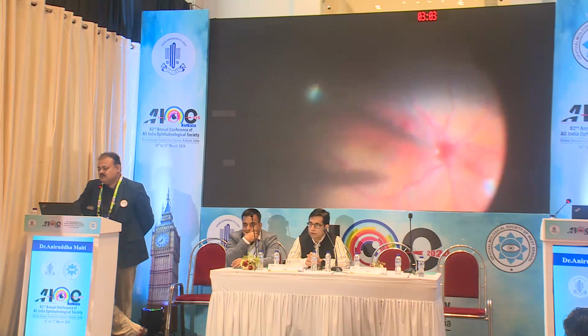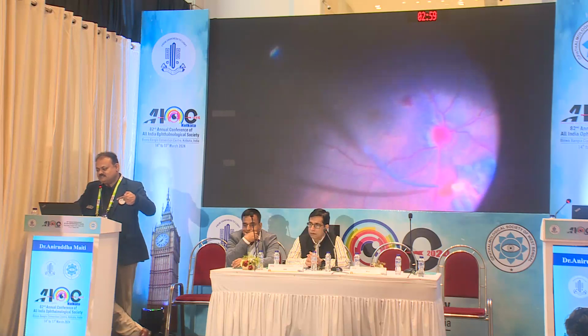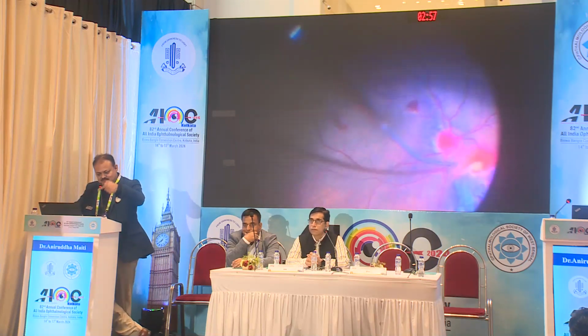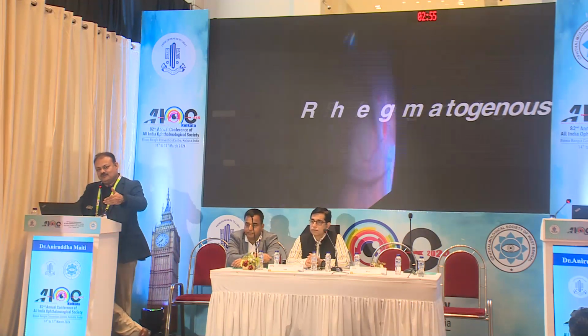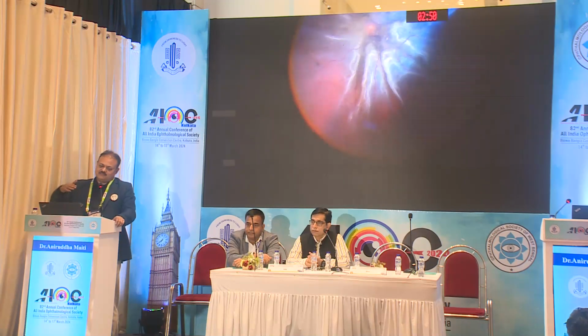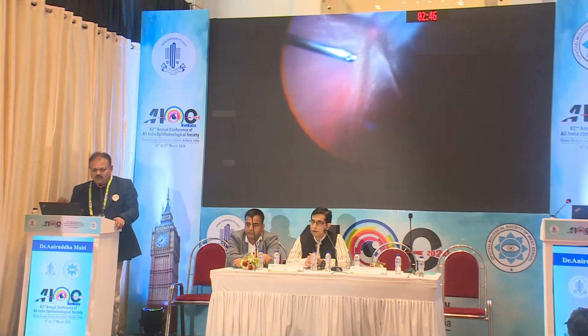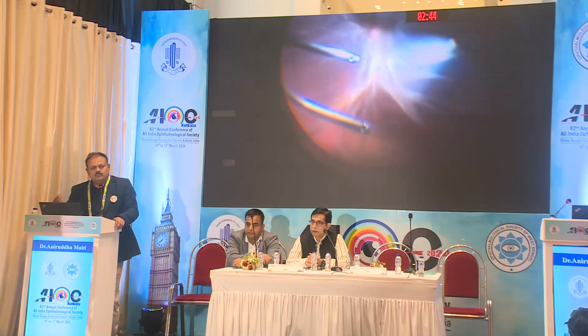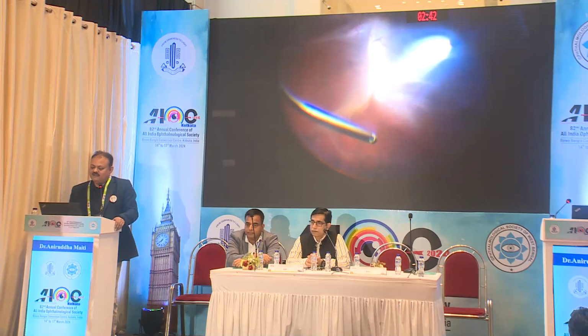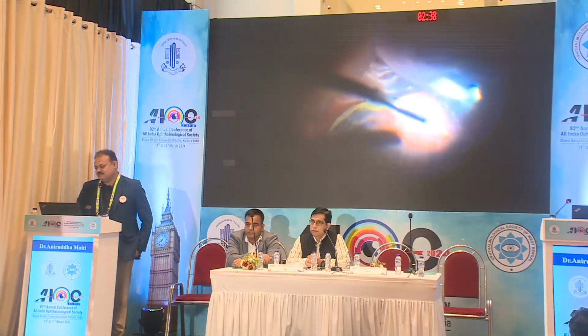The only good part was it was directed not in the center of the posterior pole. Whenever you put the dye in, direct it towards the nasal side in a very controlled way, drop by drop fashion. That is the main point.